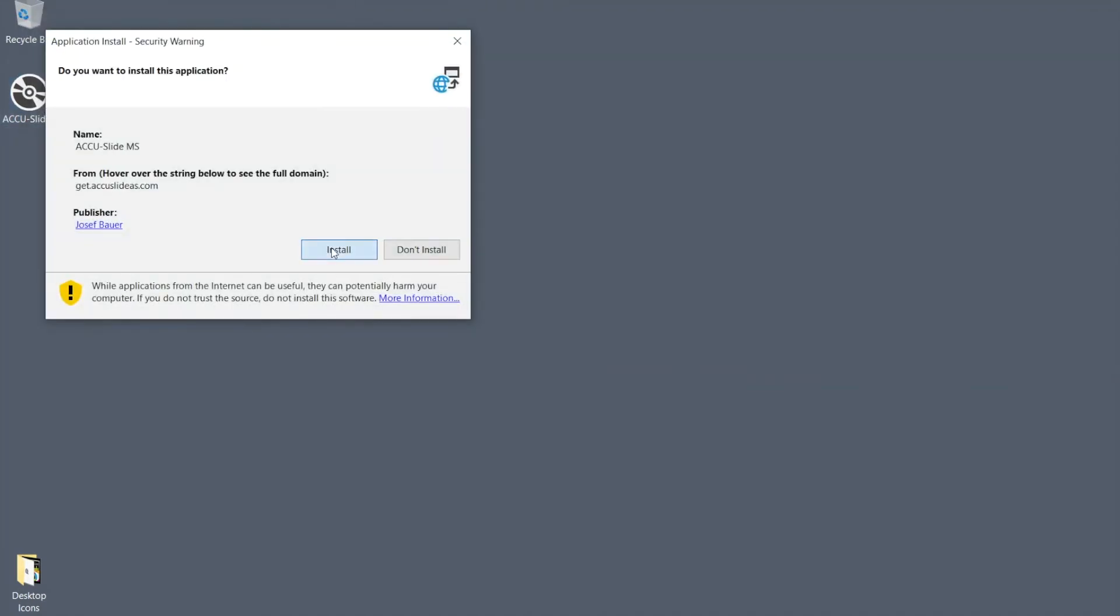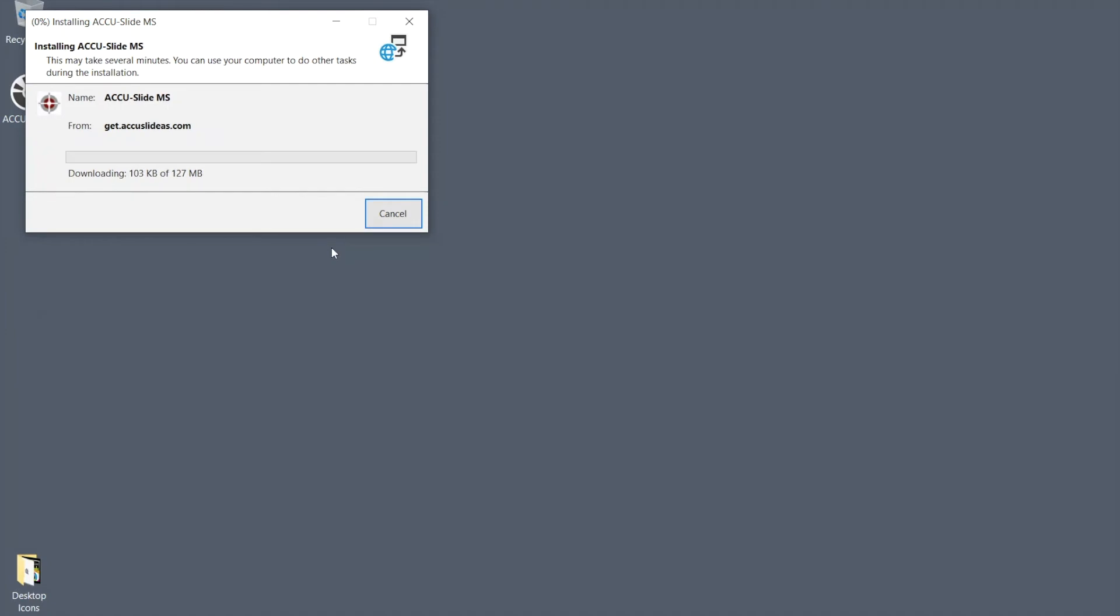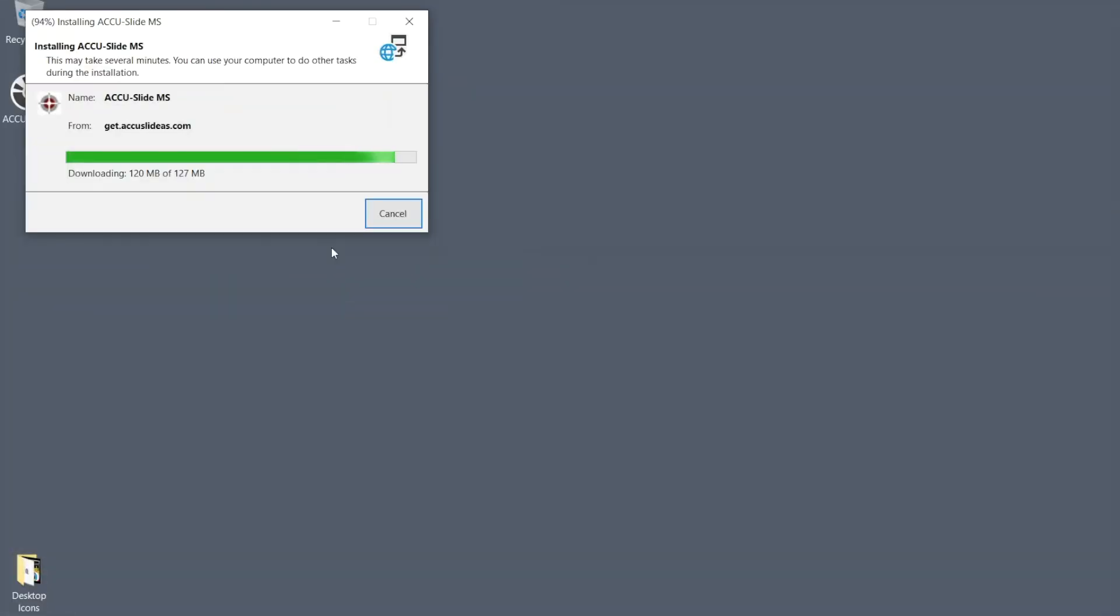The setup file will then download and automatically install the most current version of AccuSlide MS from the cloud, so an internet connection is necessary.